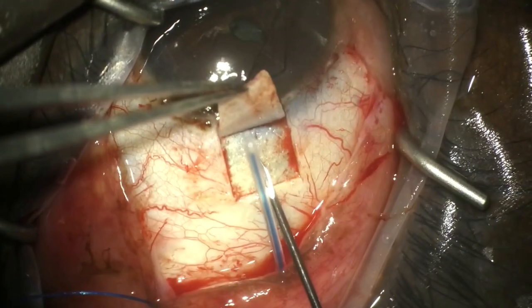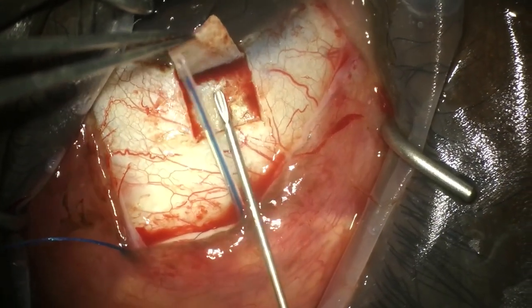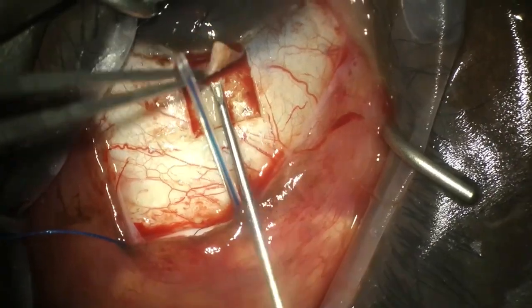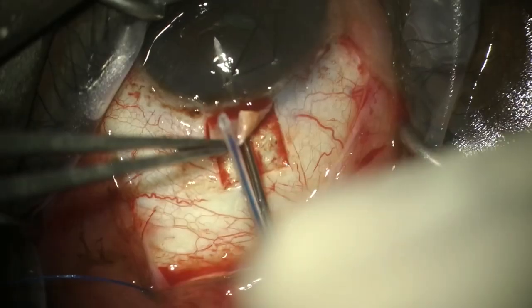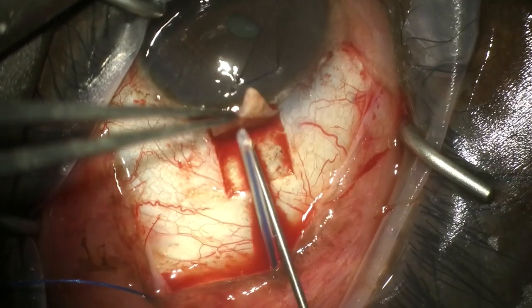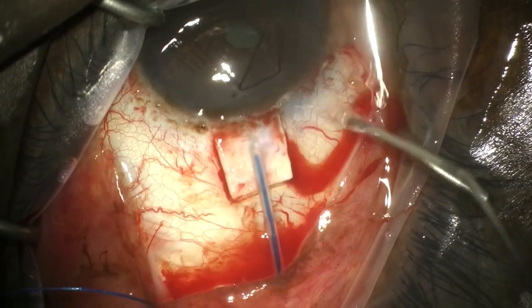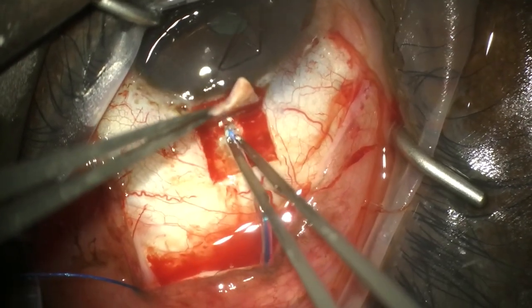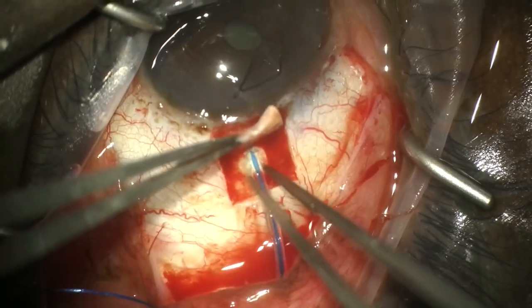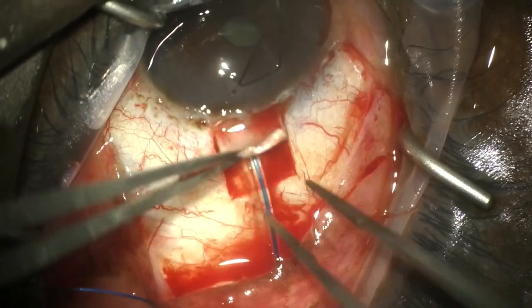We measure 2 millimeters back and go under the flap at that point. When we hit the scleral spur, which is much more visible under the flap, we change the angle of the needle to be parallel with the iris. As we come out we lose a little pressure within the eye, so we make a paracentesis to firm up the eye, and then the tube passes relatively easily through the 25-gauge needle track we've created.